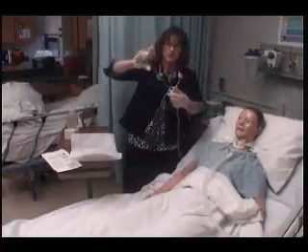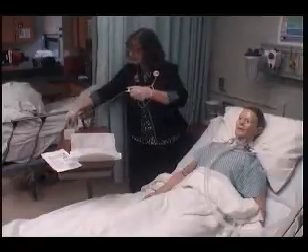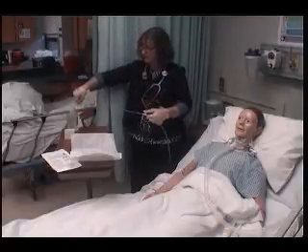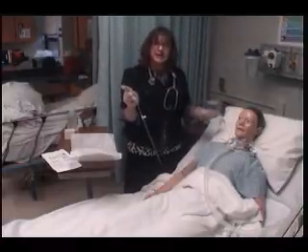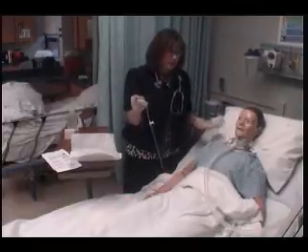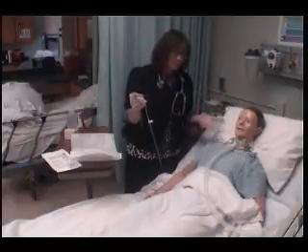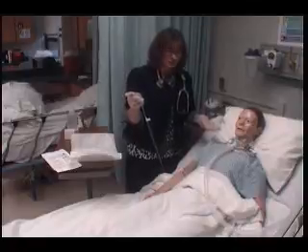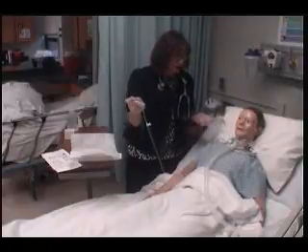Now I put his trach collar back to give him oxygen and let him recover while I come over and clean my suction catheter. Notice how I'm holding my catheter — it's not flopping everywhere; I'm holding it so that it remains sterile. In between suctions I can only go up to three times total. I need to assess: what is his respiratory rate doing? I have to wait at least a minute. What's his pulse ox? I may be able to hear that he's still gurgling from the outside. 'Sir, can you take a deep breath and try to cough some of that up?' He's still not able to cough it up.